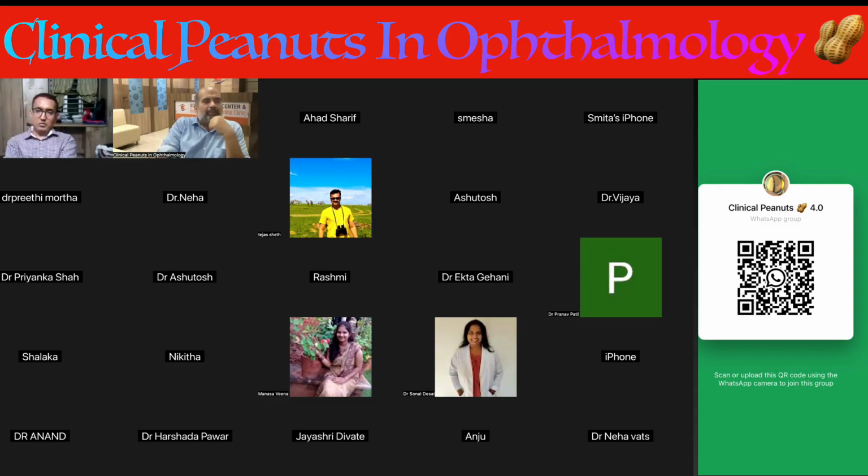So you feel that with-the-rule astigmatism is a good astigmatism? You can leave up to 0.5 if you're leaving. It has been seen with the monofocal lenses. We have done some short studies where we were looking at residual astigmatism with the monofocal IOLs, and we found that if you're leaving 0.75 astigmatism in the vertical plane, patients are having good near vision also. They are having N8 without correction with the normal lenses. So then you can charge more for the same package.